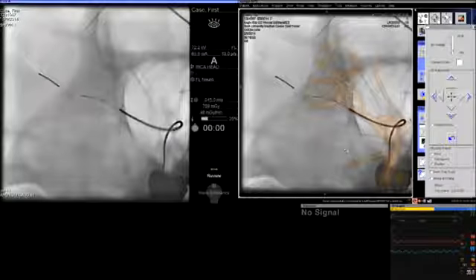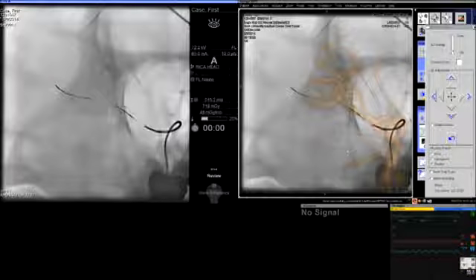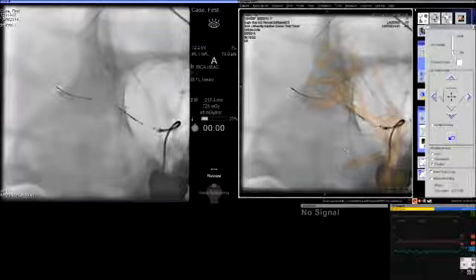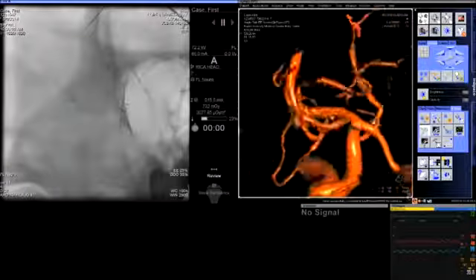And once you have this stent deployed, sometimes the wire can get caught. You can see right there that you can have a little bit of resistance to pull the wire back out of the delivery system of the stent. This has to be done very carefully, so you may have to push forward and then back so that you're able to release the wire from the two stents. But the last thing you want to do here is to move the Y stent construct, because it gets caught in the bumpers of your delivery system.